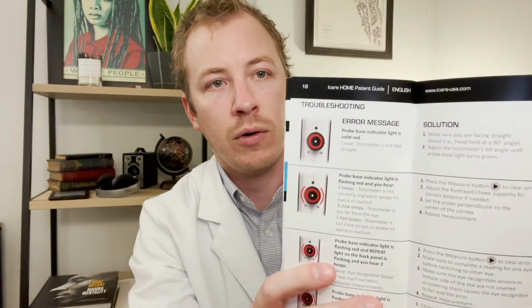Again, there's the guide. And I wanted to show that to you. It's a great guide. I mean, this is one of the better guides I've seen for a medical device, honestly. So if you're not sure, it's on page 18 to 19.